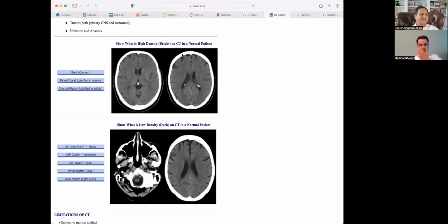So there is something called a bone window, where we create a filter for the lower Hounsfield unit. Anything below 0, cut it off. What it will do is that anything which is only slightly positive will become much darker or absent. So right now, if you look at this bone here, it is very dense and has no information, no detail. It's completely black, completely white.